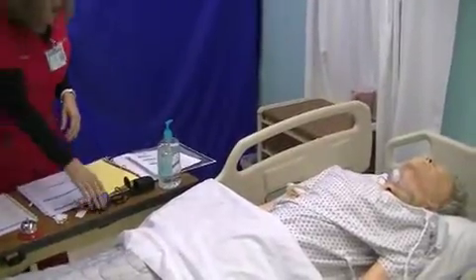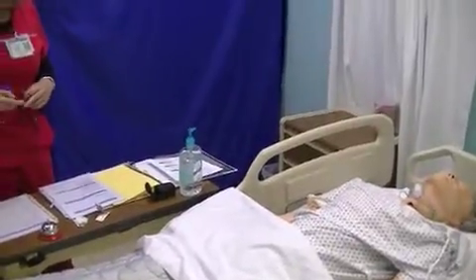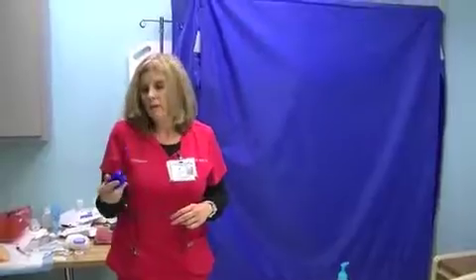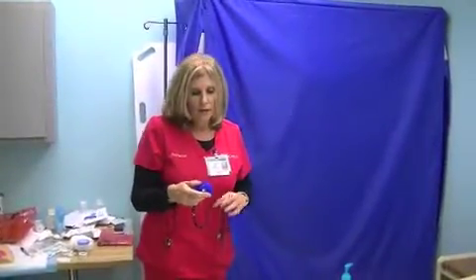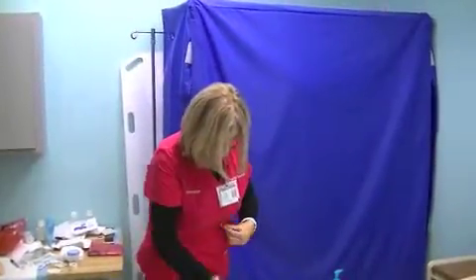If it's an adhesive probe and we need to leave it on a long period of time, we're going to make sure we alternate it, because they can develop an allergy. And also, if you have a clip one, like if it's a continuous monitoring, we want to make sure that we rotate the site, because the patient's skin can break down with the clip too long.